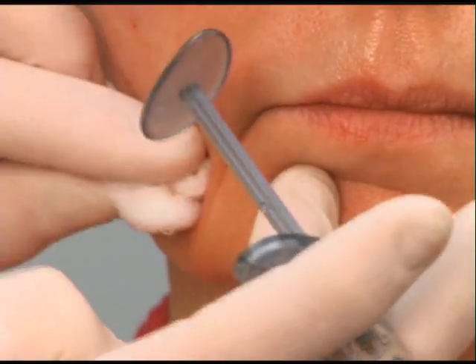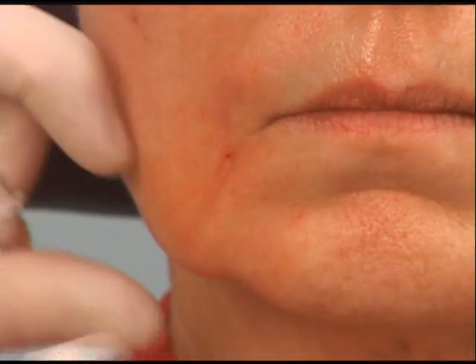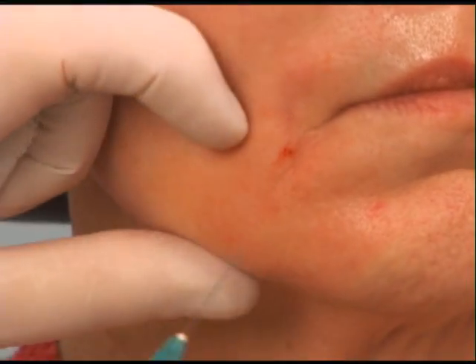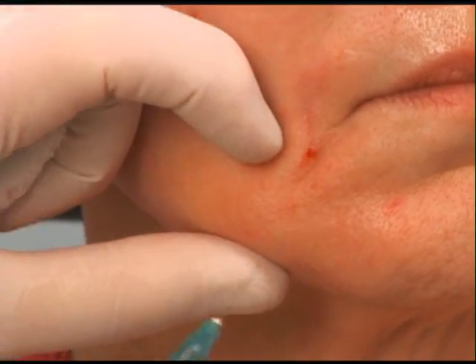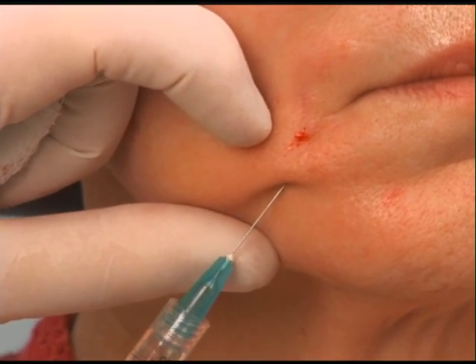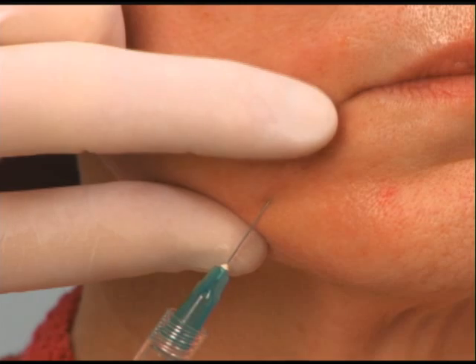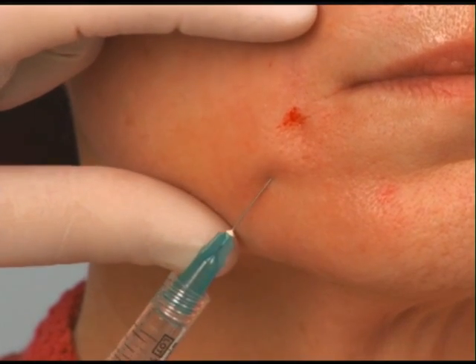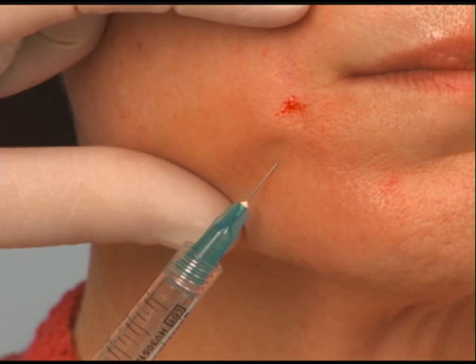First I'm going to come in subdermally with the 27 gauge. I'm going to start at the bottom of that depression, and a lot of times I'll push forward as I go just so I can aim. I'm going to go in subdermal and aim for the very corner of the commissure.